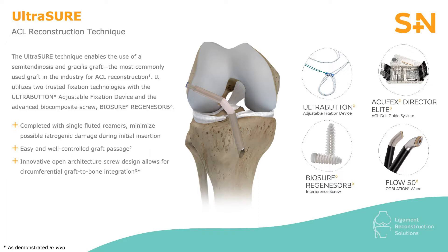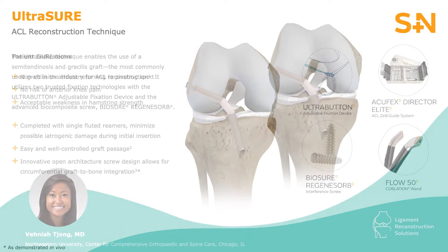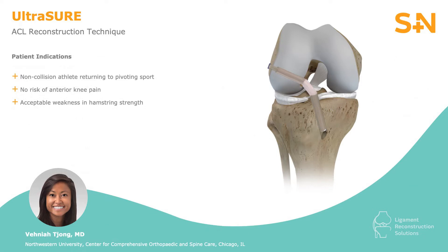This screw has an open architecture to allow for more bony in-growth as the graft incorporates, and the screwdriver itself seats nearly the entire length of the screw, which decreases the risk of any intraoperative screw failure upon entry. Hamstring tendon autograft ACL reconstruction is used predominantly for non-collision athletes who wish to return to cutting and pivoting sports, and those who prefer to avoid any risk of anterior kneeling pain sometimes caused by bone patellar tendon bone autografts.